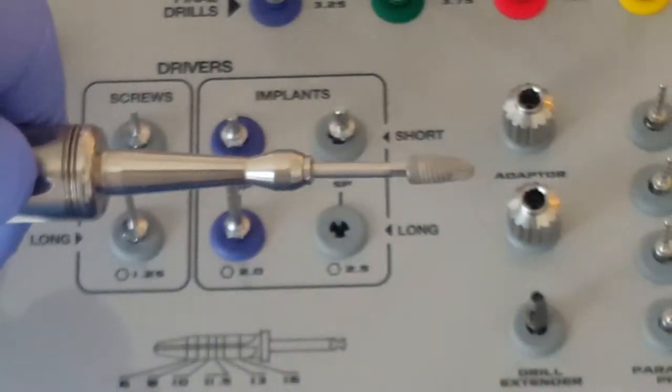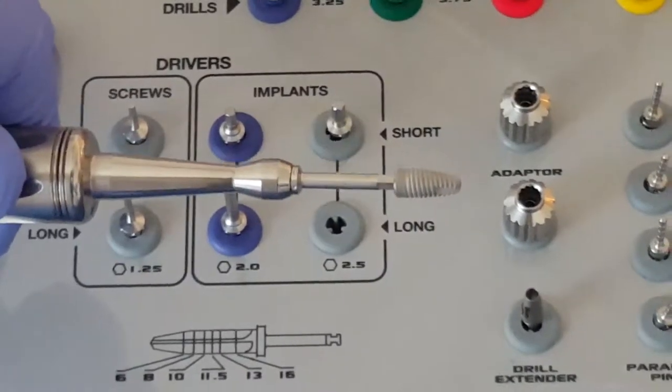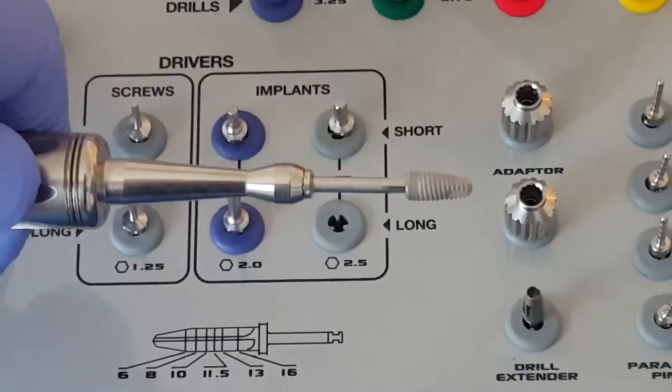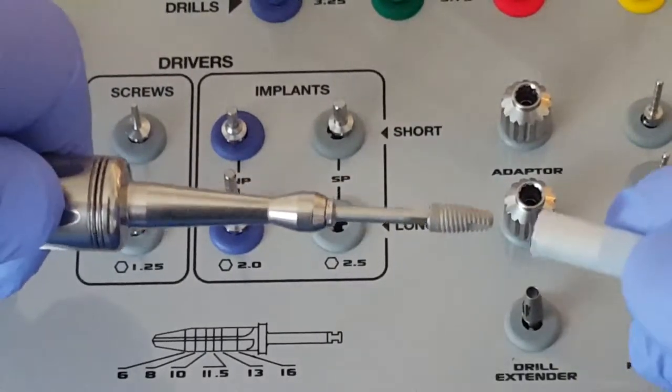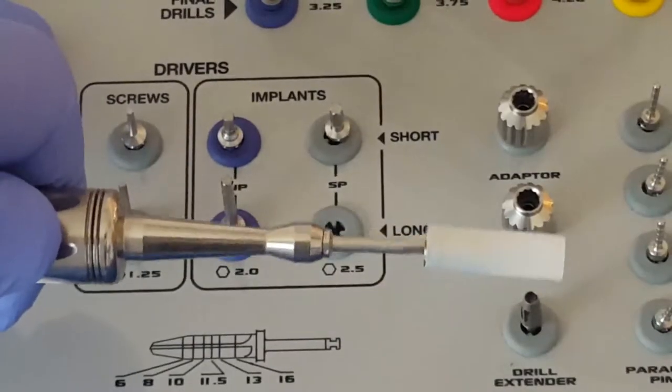If the implant was inserted or partially inserted and then required removal so there can be re-preparation of the osteotomy, then the implant can be re-inserted into its vial and completely encased in titanium without fear of contamination.